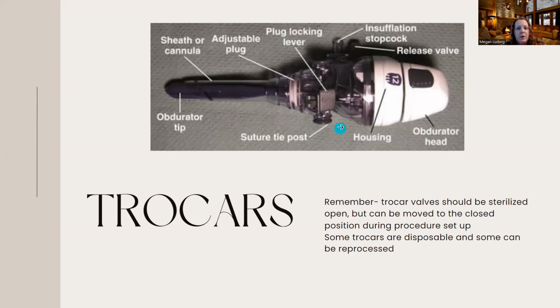So this one's a little different in that it has a suture tying post. You can put a suture around this, pass it through the skin or subcu tissue to anchor it. That keeps it from getting pulled out. It just kind of stays placed, which is nice.